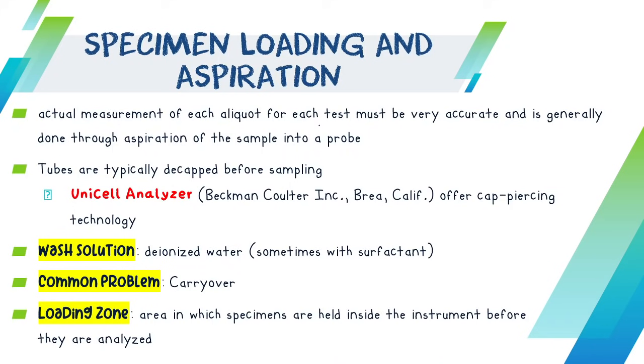So we have this what we call your loading zone, and I guess na-mention ko na siya. Now, loading zone is the area in which specimens are held inside the instrument before they are being analyzed.